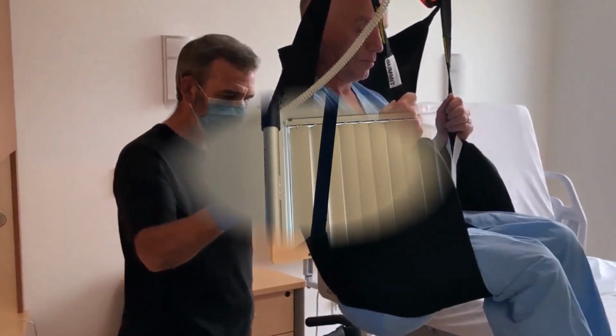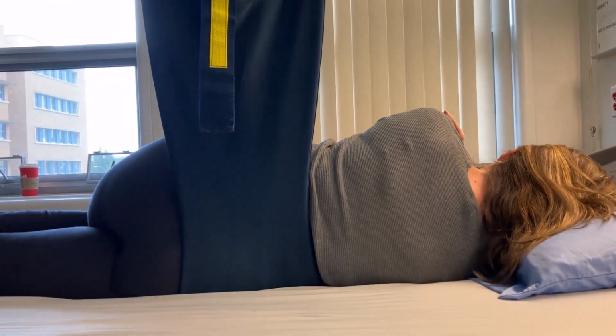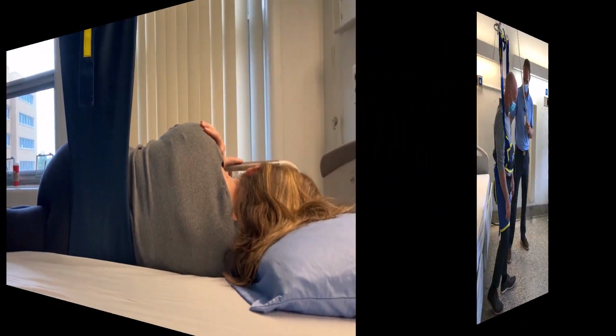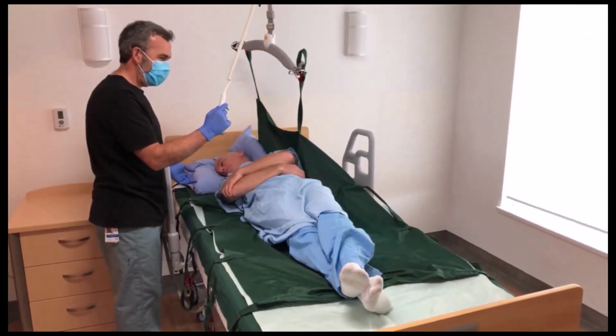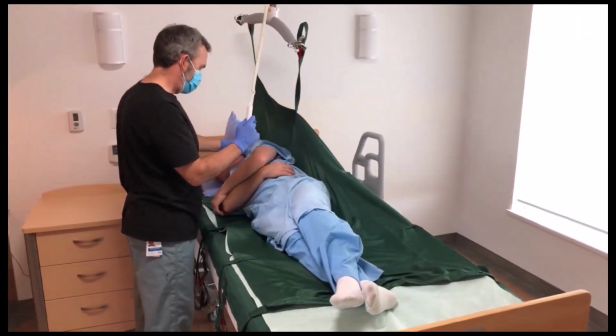healthcare settings. Common procedures for using a lift would be transferring patients in and out of bed, to a chair, toilet, stretcher, and can even be an effective tool for fall prevention. Like during assisted standing and walking tasks, as well as bathing tasks. The ceiling lift makes it the safest method for the caregiver to lift and transfer the patient, resident or client while still providing comfort and dignity.